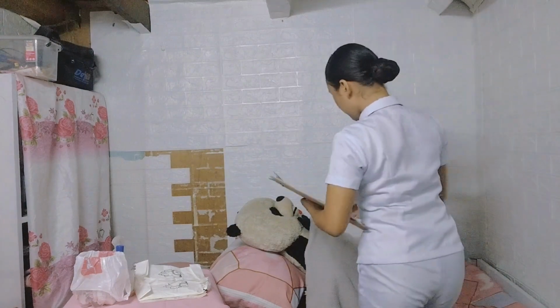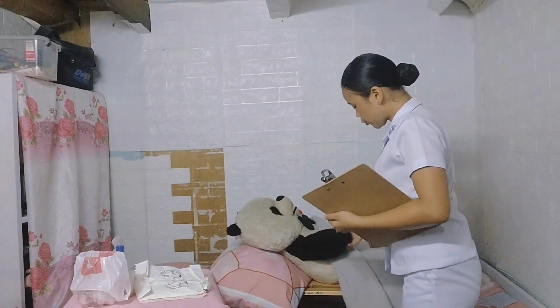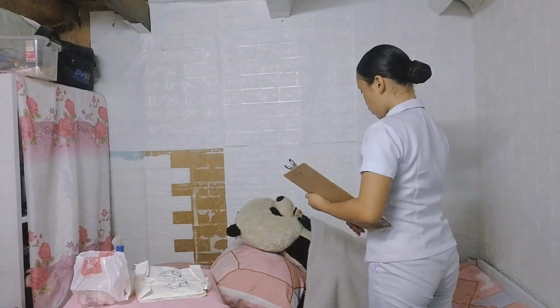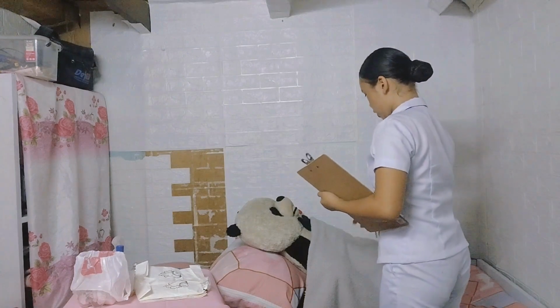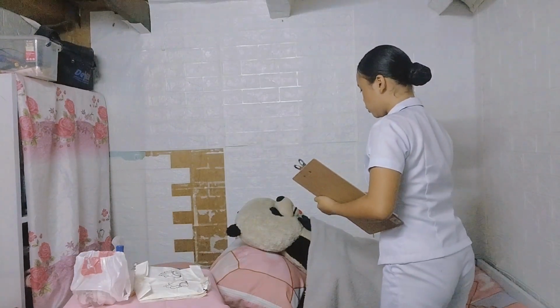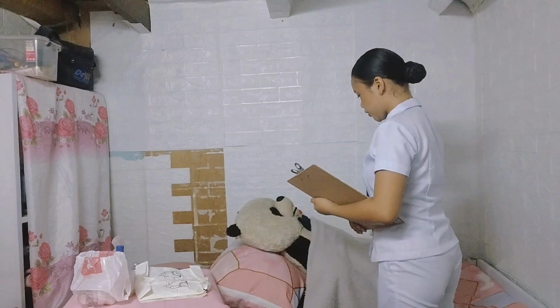Good morning, sir. I am Karine Faye Buka, your student nurse for today. For verification, sir, may I see your wristband? Please state your complete name and your birthday. Okay. Today, sir, I am going to give you the medication through intramuscular injection. This medication will go directly to your bloodstream. While I am injecting, sir, I want you not to move so that you won't get hurt. Is that okay, sir? Okay. Do you have any clarification or concern?